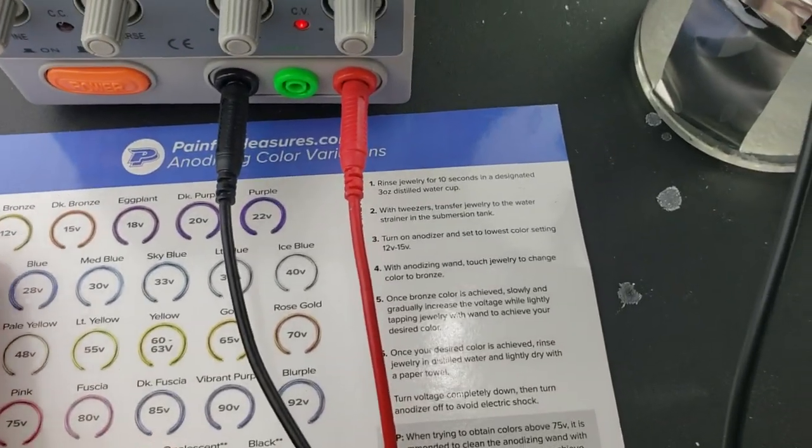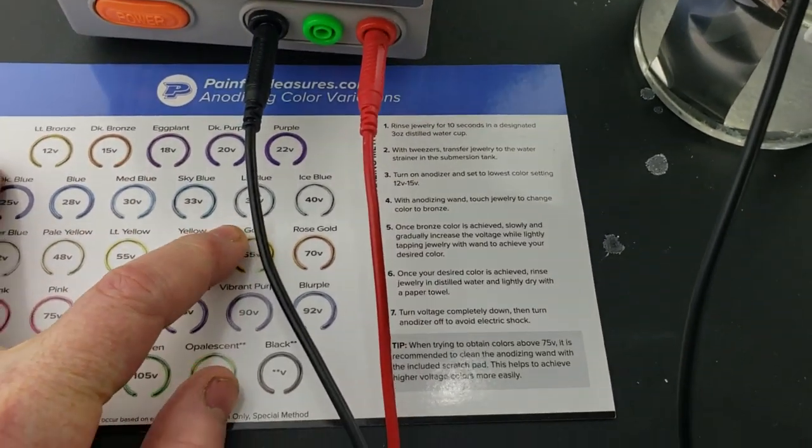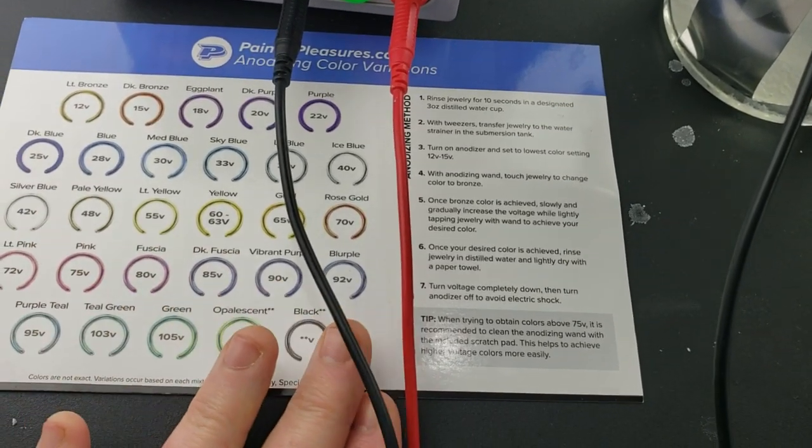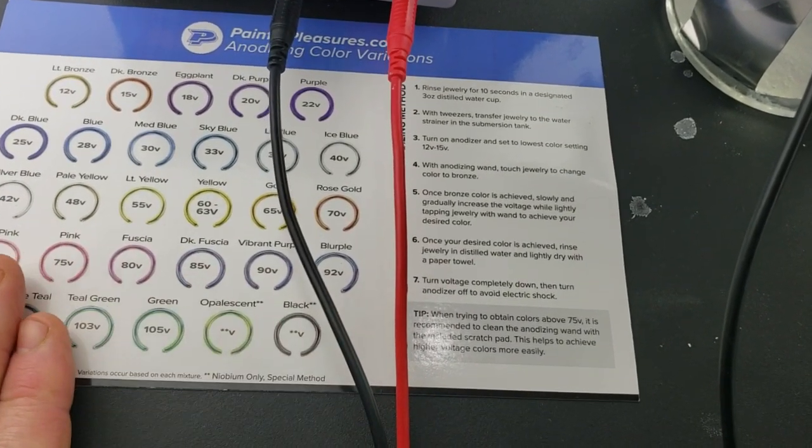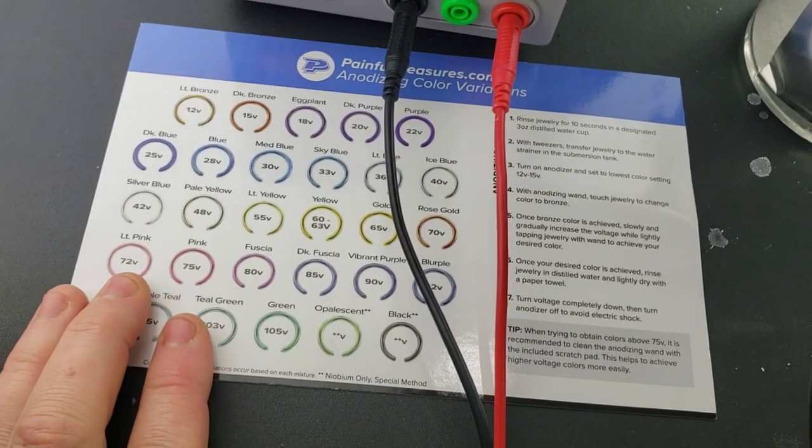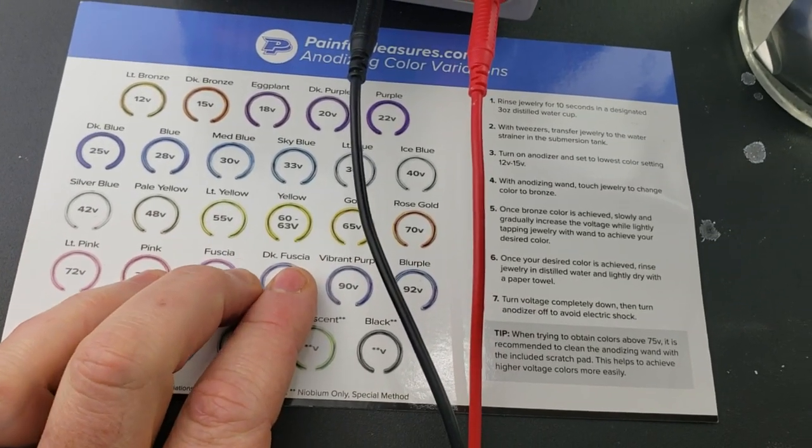The way this happens is the titanium goes through all these colors until it gets to the one you're aiming for. Initially, I'm going to put the entire thing in and anodize it in gold.